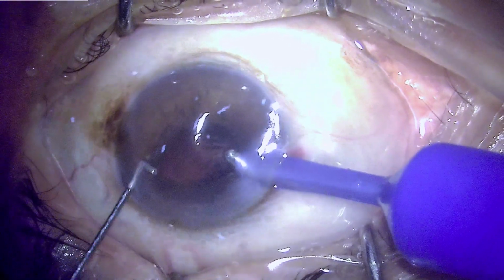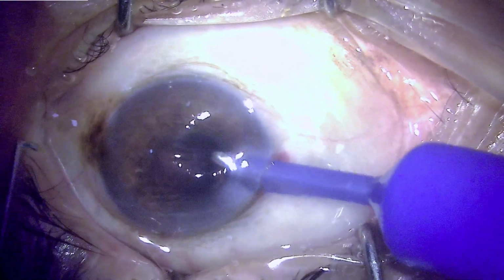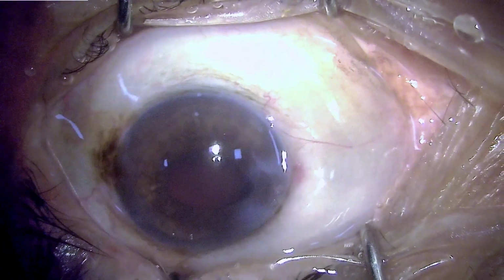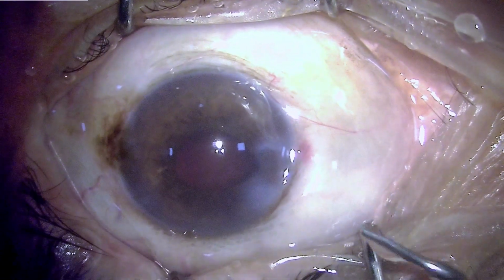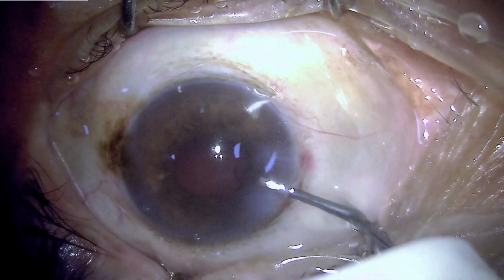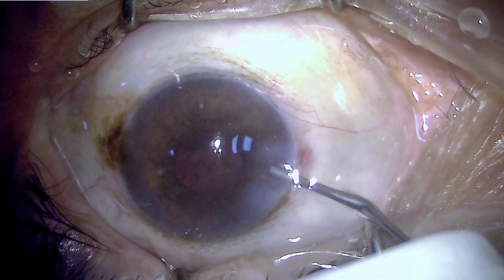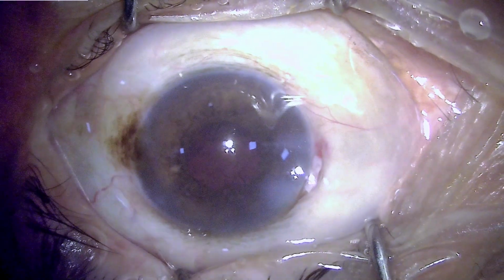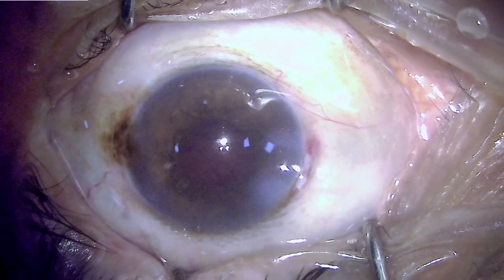Again coming out of the chamber after switching off the irrigation, and also at the same time repositing the iris. Leaving the anterior chamber with some amount of fluid just to maintain the anatomy of the anterior chamber, inflating the anterior chamber, and before that one has to deflate it so that the iris prolapse can be reposited back.